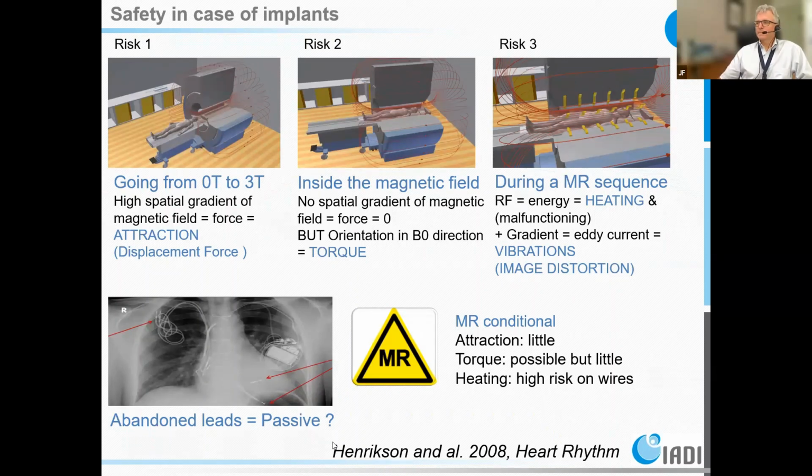Okay. There are two questions. I don't know where the questions are. Can you read it? So there was one comment again on the pacemaker. She wrote, you need a cardiologist specialist present to turn it on to MR compatible mode, and then after turn it back to normal mode. That's perfect. Yeah, this I will explain later in the next step because it's a lot of information. In theory, you have an MR conditional pacemaker.